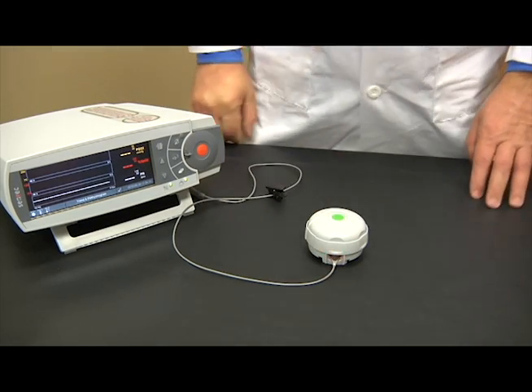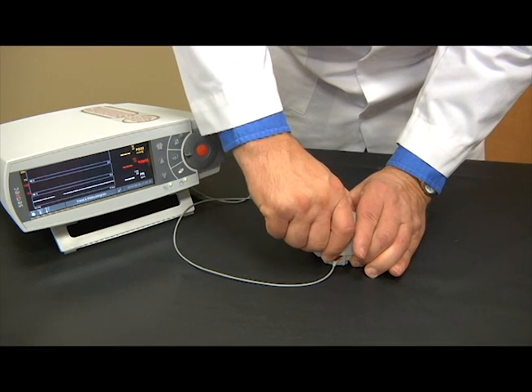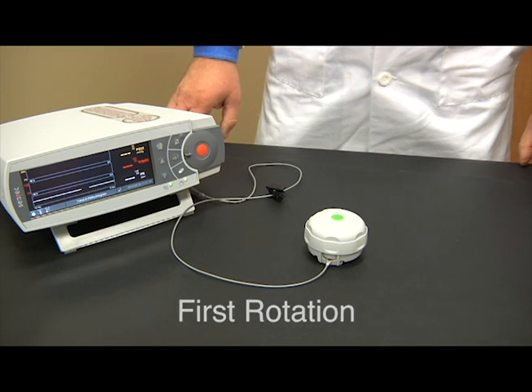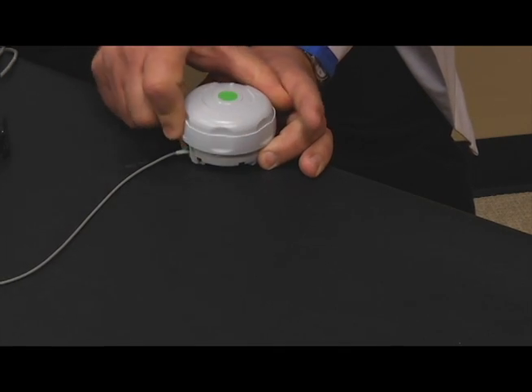Next, grab the bottom portion of the two-part case with one hand and the top with the other. Note the directional arrow on the top of the tool and turn the top portion one click clockwise. The tool will stop at the second station. This is sometimes easier if you slide the membrane tool to the edge of the table in order to maintain a firm grip.